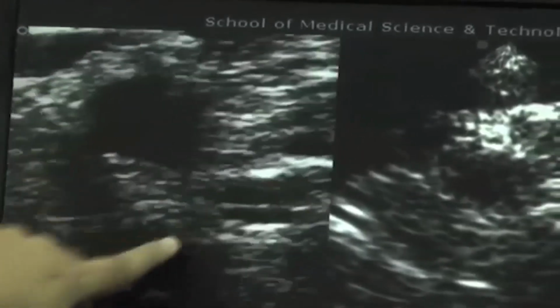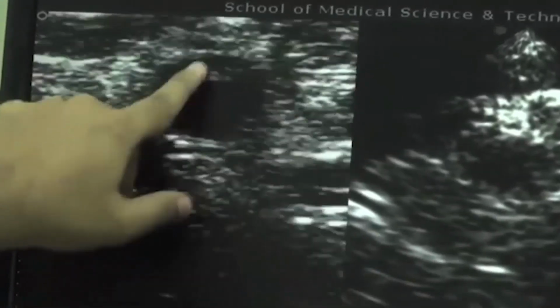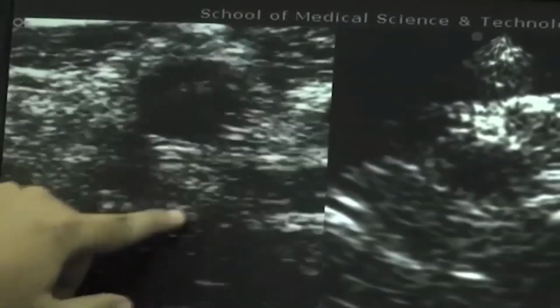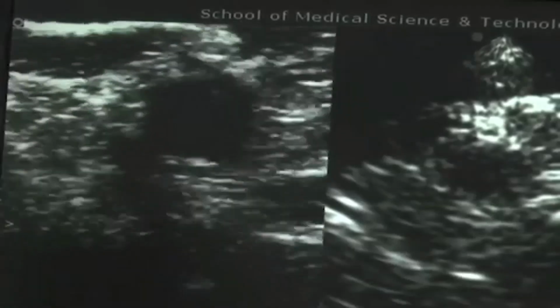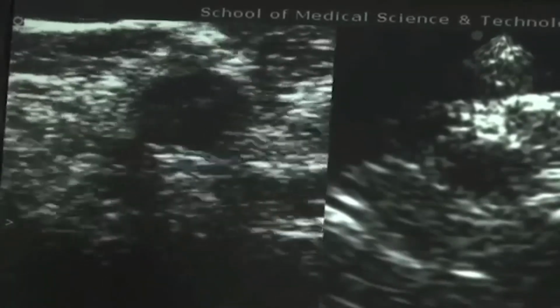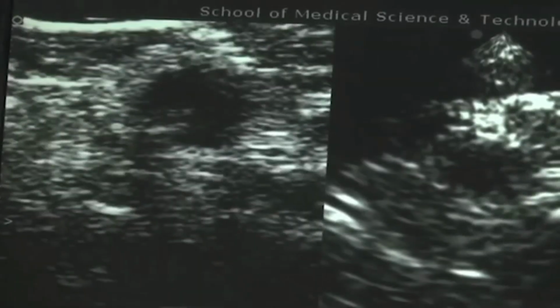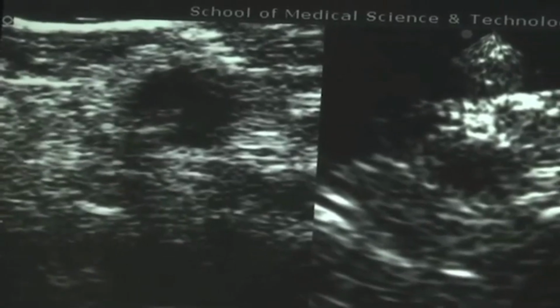One of the interesting things is you will see beyond the carotid artery, this is where the artery is and the blood is flowing, you see this enhanced region, the speckles are much brighter, and that's called the enhancement. There will be a rim of shadows coming down over there which is clinically relevant, and let's just freeze this one. Yeah, so I've just frozen it. So that has acquired the frame and kept it over there.